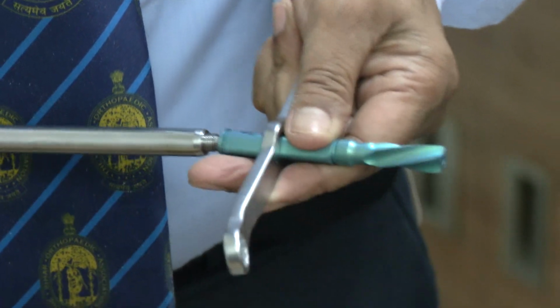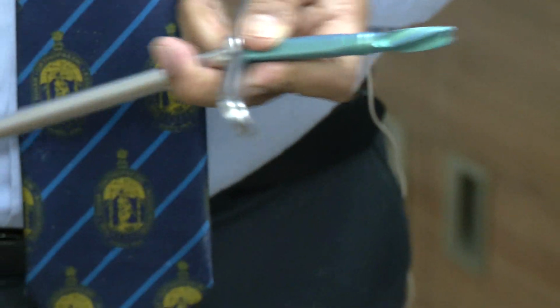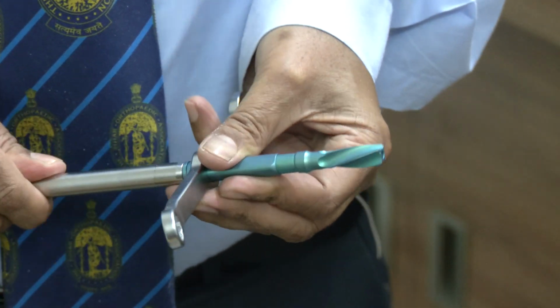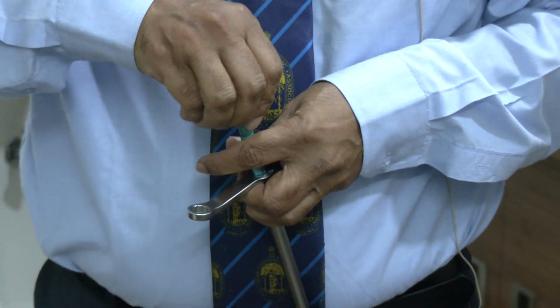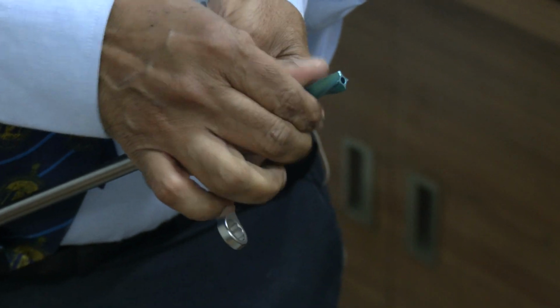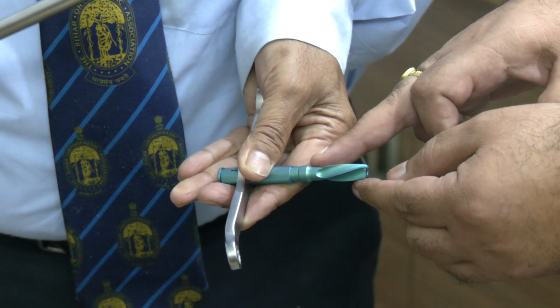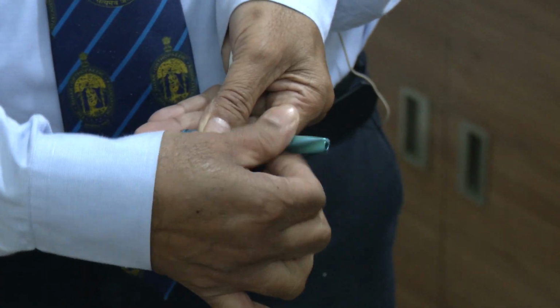Normally the assistant opens this helical blade with the screwdriver, and he will play like this. He is not having any job to do, so he keeps on playing with this. This is opened up now more than what the screwdriver can compact. So now I remove the screwdriver without checking. The screwdriver has already come, but you can see that the helical blade is not locked. So it won't serve the purpose.